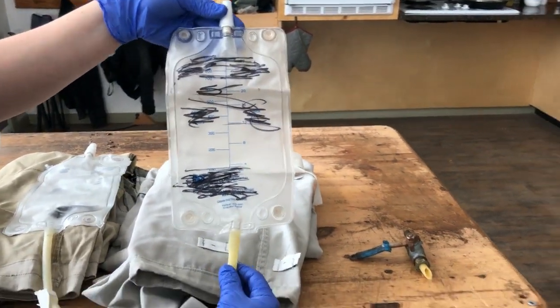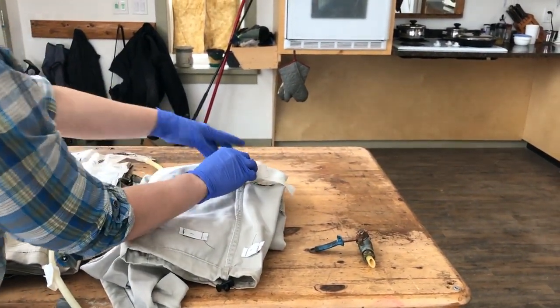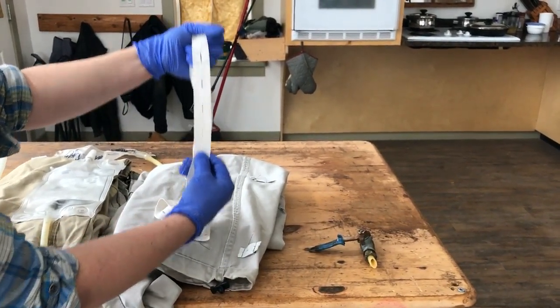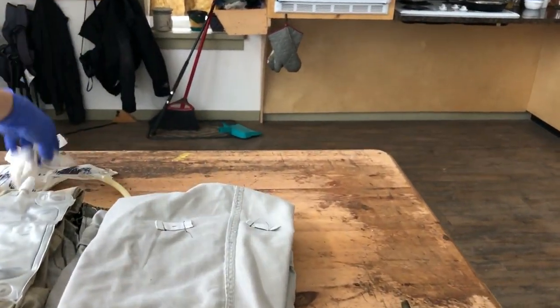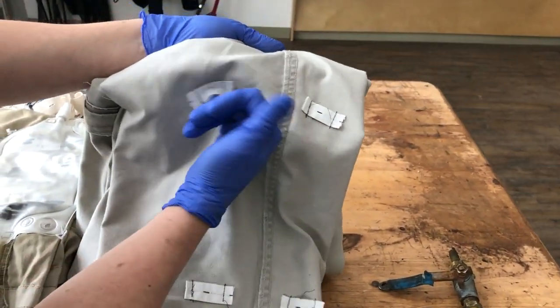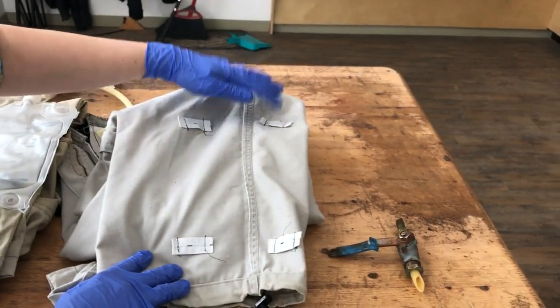And to attach it to your pants, go down to your sewing supply store, and you can buy this buttonhole elastic by the roll. So you just cut out one piece individually and sew it in the proper position onto the inside of your pant leg. So in 4 spots, and then you can attach it nicely and it'll stay there.